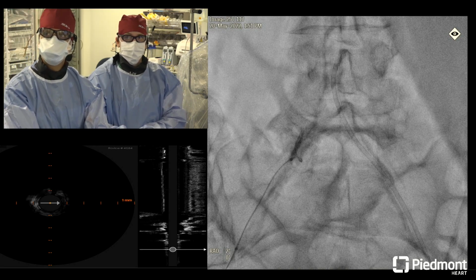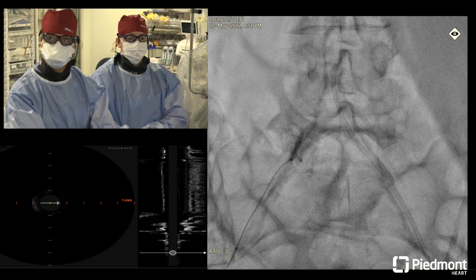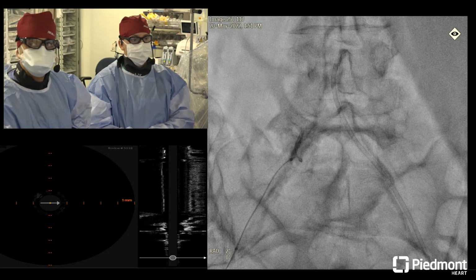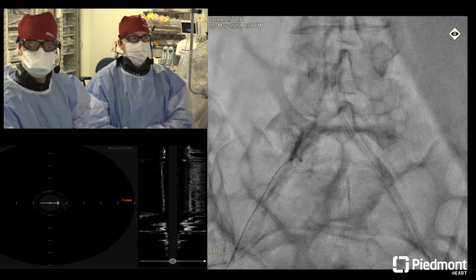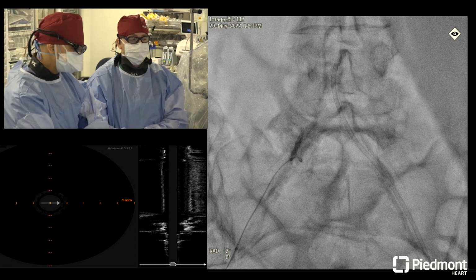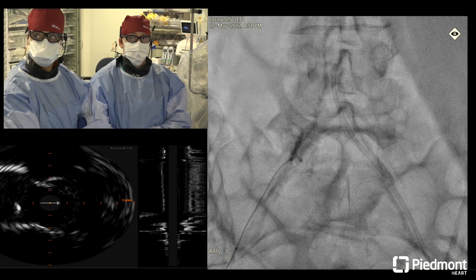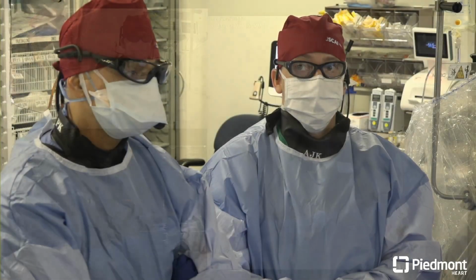Yeah, I think IVUS can be very useful here, even from your contralateral side. It can precisely show you where the bifurcation, the carina, is going to be, so you can use that to landmark where you might need to re-enter. I think that's important. And you're right, this is so calcified, I think you're going to get subintimal. Maybe there are a few stellar operators, not me, that can get through this true lumen the whole way, but I think that's less likely. So I'd probably dissect like you're doing, get up near where I want to re-enter, and then use ultrasound IVUS-guided re-entry here with the Pioneer system.